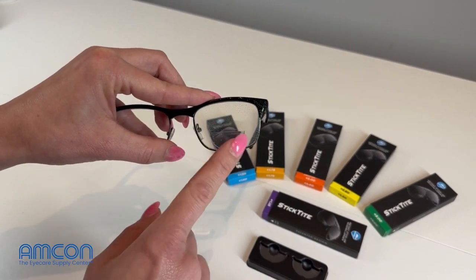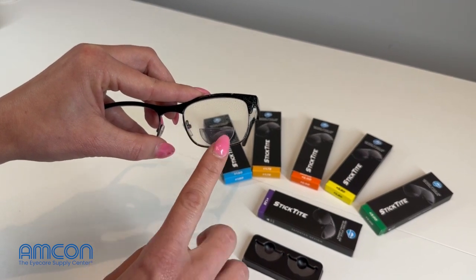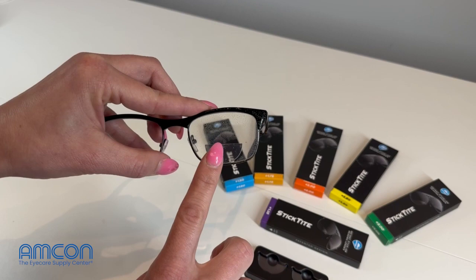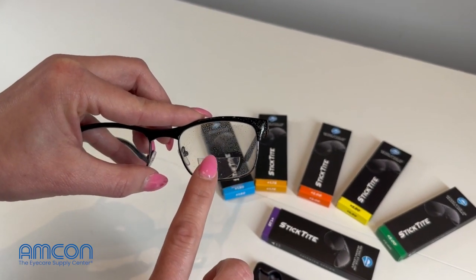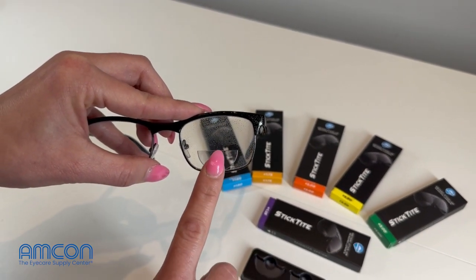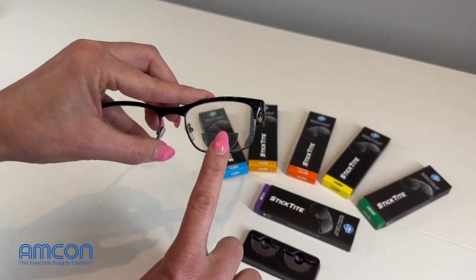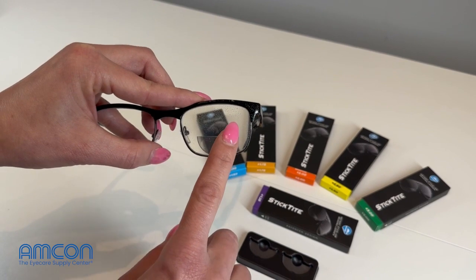It's going to take a couple of minutes for the lens to fully stick to itself. The longer that you let it set, the more these air bubbles are going to go out and the more that lens is actually going to stick to the eyeglass lens and not move. As you can tell in this case, it's already starting to happen.